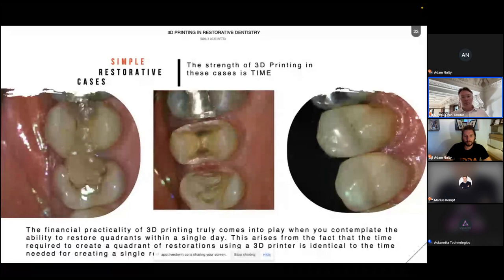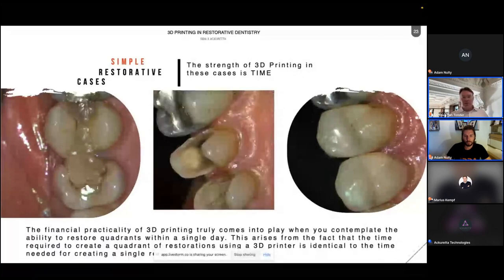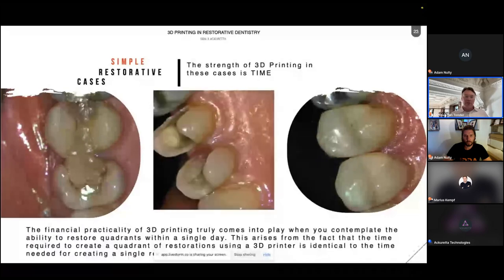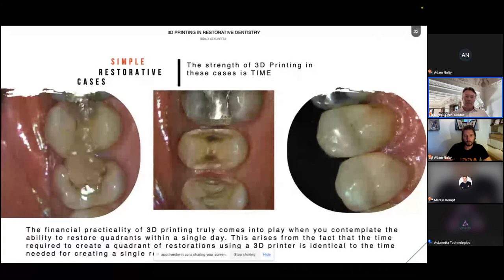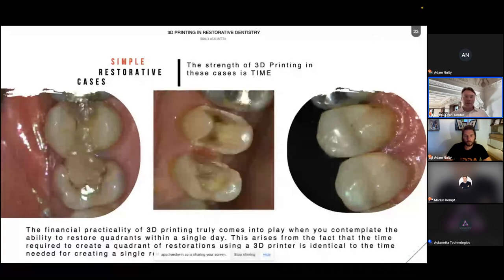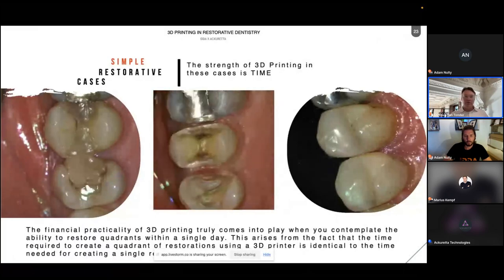Okay, so one of the things I was just saying is that the most important thing with these is your case selection. Make sure that you choose the right patient for these restorations, that your occlusion is checked and your excursion movements, all of those things are important, especially when you are using 3D printed resins. And as we said at the beginning, this is still very, very new technology.